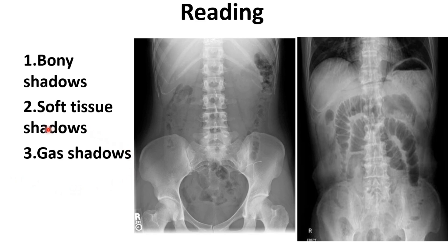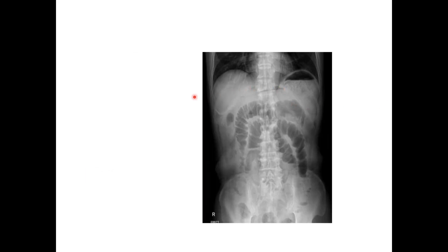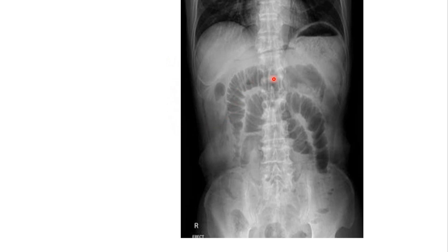The last shadow type is gas shadow. The first gas shadow you can see is under the left dome of the diaphragm — this is the fundus of the stomach, which we have already seen in the X-ray of the thoracic cage. Another type is scattered gas shadows seen in the intestine, often intermixed with fecal material and therefore interrupted. You can see intestinal gas shadows in both the abdominal and pelvic cavities. In another X-ray, the gas shadow in the small intestine forms a uniform pattern known as the step ladder pattern, seen in intestinal obstruction.